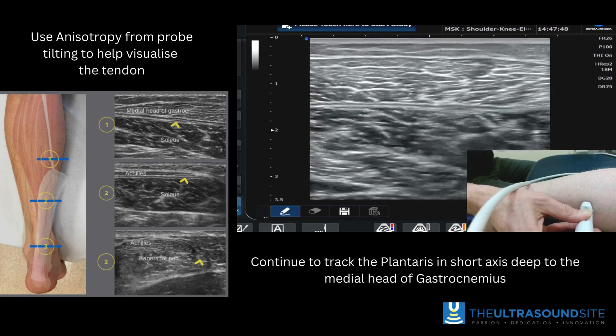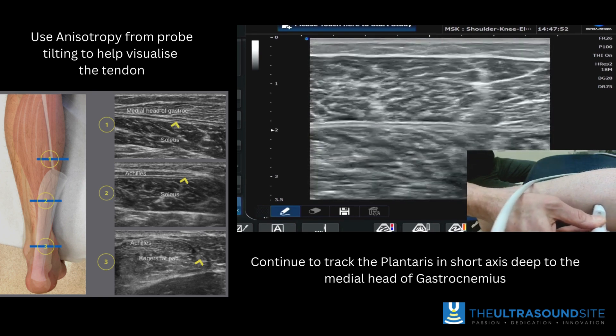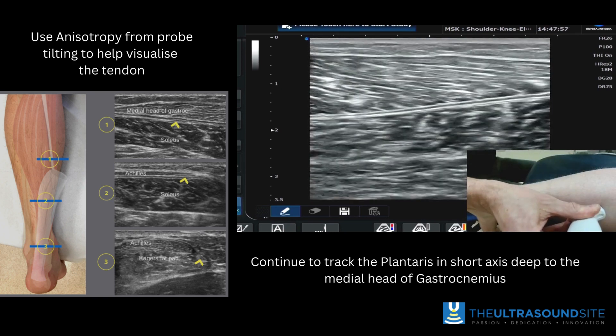As we become more proximal, that starts to dive deeper. You'll need to maybe change your machine settings if you have a larger patient — think about your frequency, gain, and depth of the image.